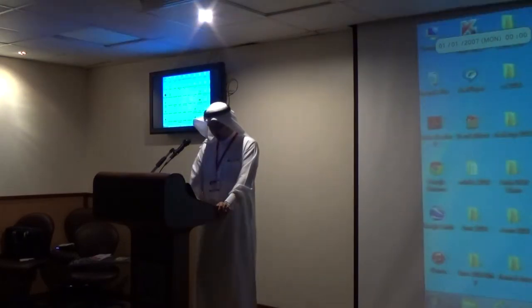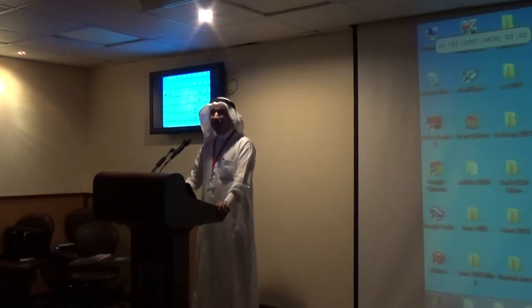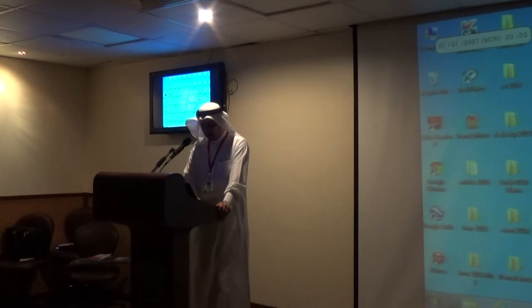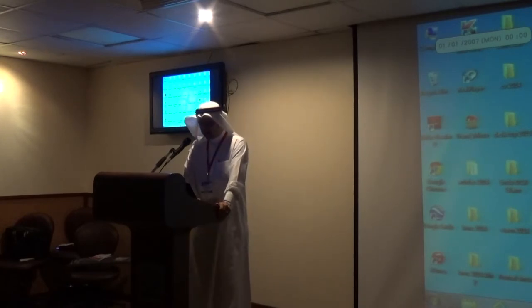My talk today will be about the endoscopic anatomy of the middle turbinate and the anterior ethmoid. We're just going to go through some tips and pearls of how to practically accomplish the first session of our dissection today.